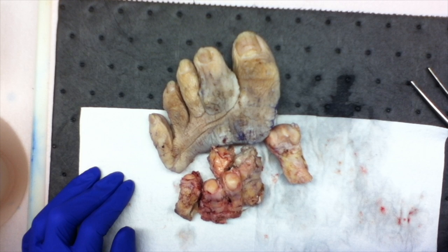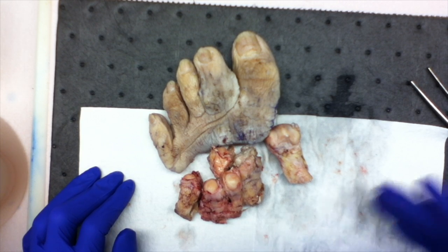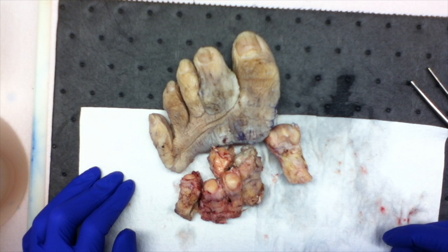So today I'm going to do a transmetatarsal amputated portion of foot. I did a toe the other day, and so now I'm just going to continue on with this extremities kind of lecture series.